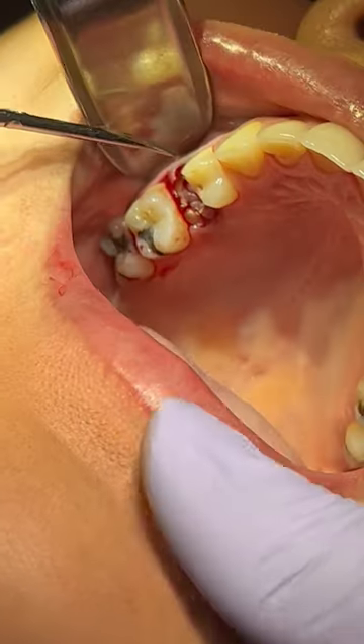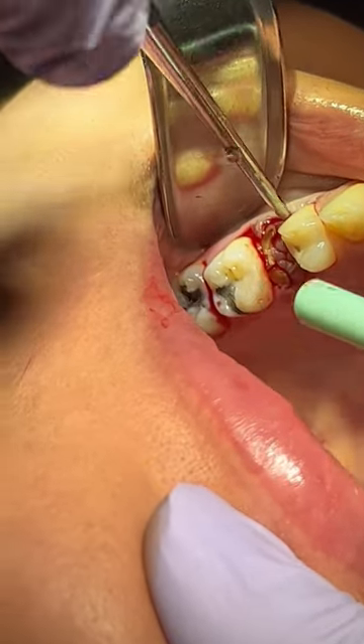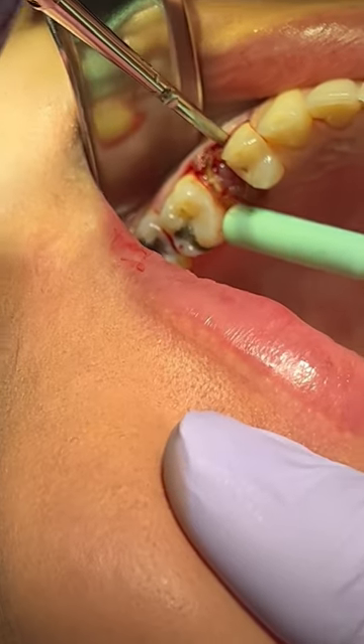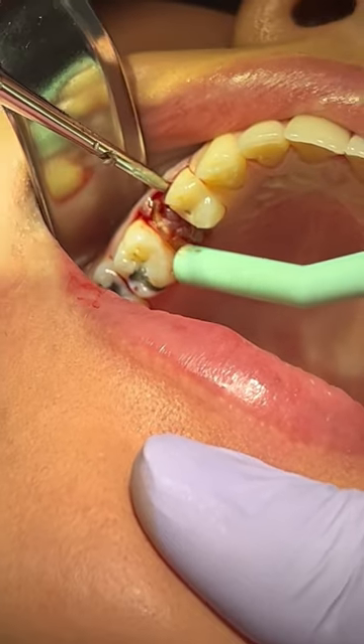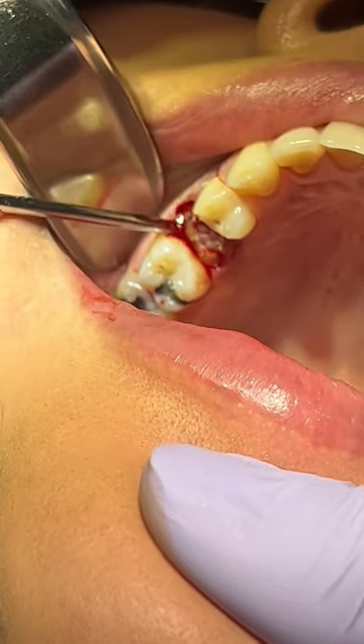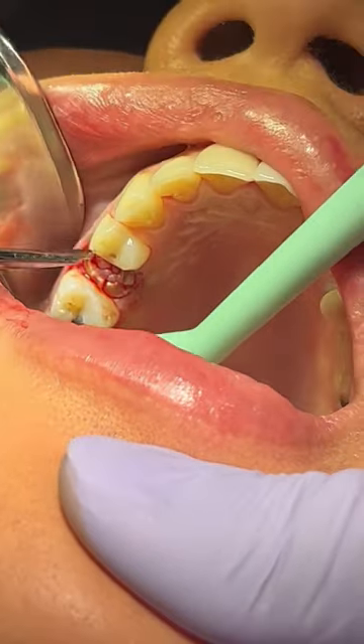One thing that I started doing is I love using the luxators. These luxators are incredible. If anybody wants to know where I got these luxators, they're pretty reasonably priced. Just email me at realdentistwithanessa@gmail.com and I'll send you the information for where you can get these pretty cheap.